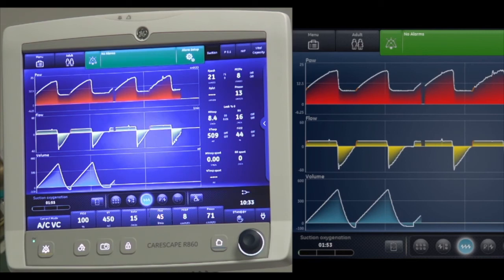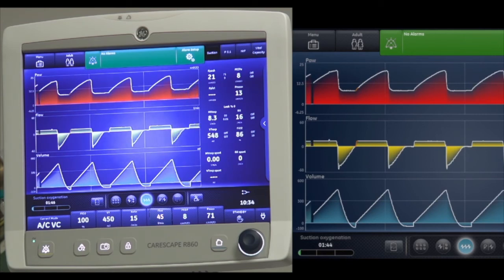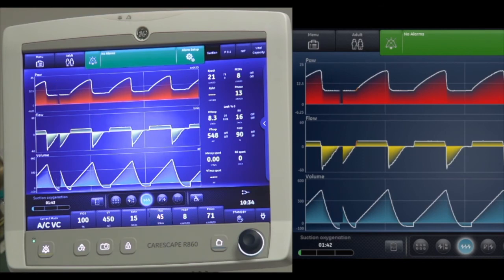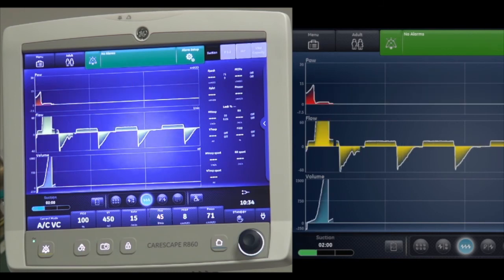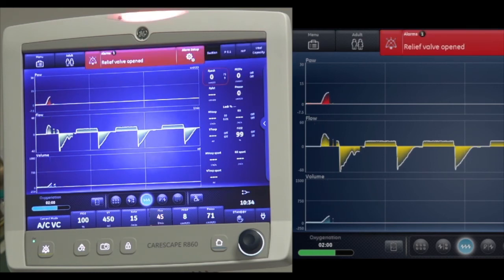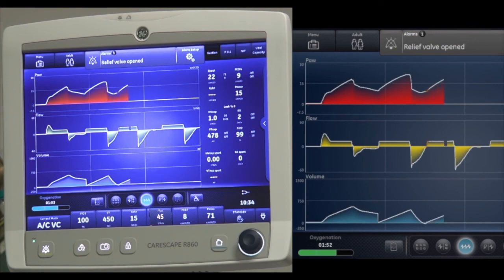Phase one is suction oxygenation — the ventilator delivers increased oxygen for two minutes or until the patient is disconnected. Phase two is suction standby — the ventilator enters suction standby for two minutes or until the patient is reconnected. Phase three is oxygenation — the ventilator resumes ventilating at current settings, delivering the increased oxygen value for two minutes.